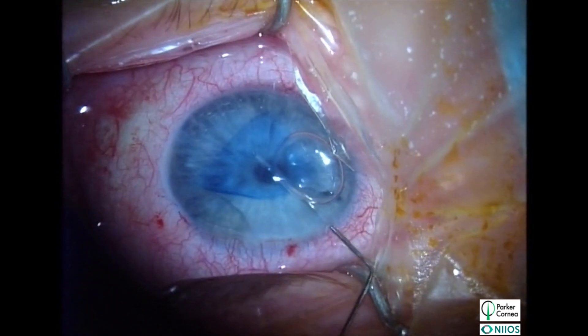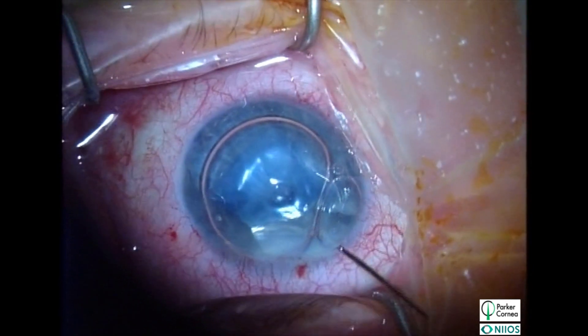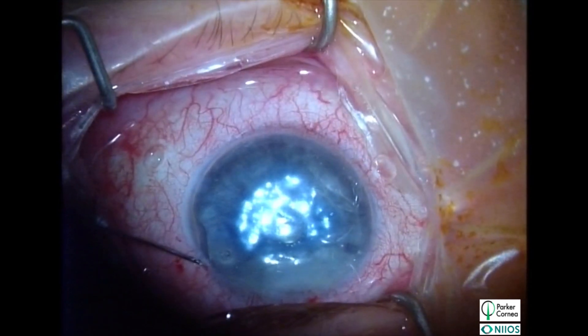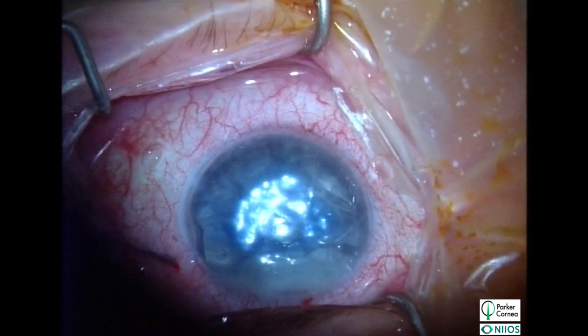After the graft is unfolded and properly centered, an air bubble can be placed behind the graft to lift it to the posterior surface of the recipient cornea. The case is concluded following near-complete air fill and when appropriate pressure is achieved.